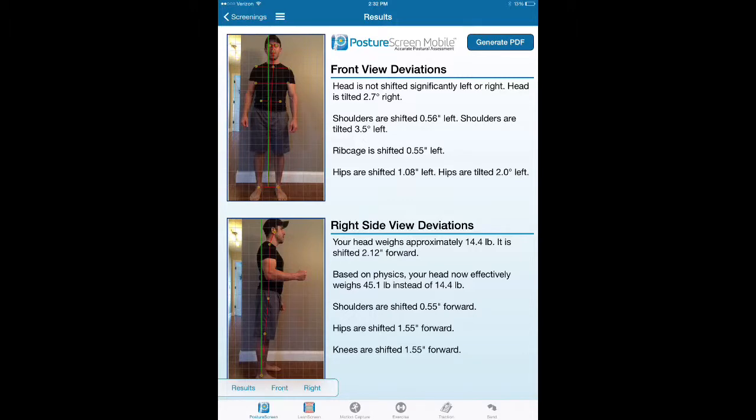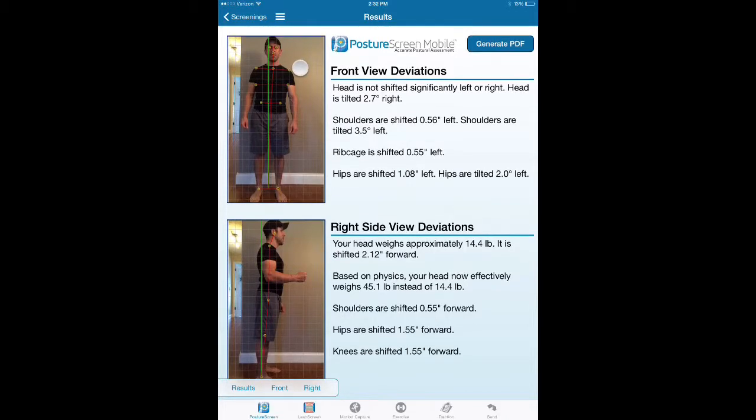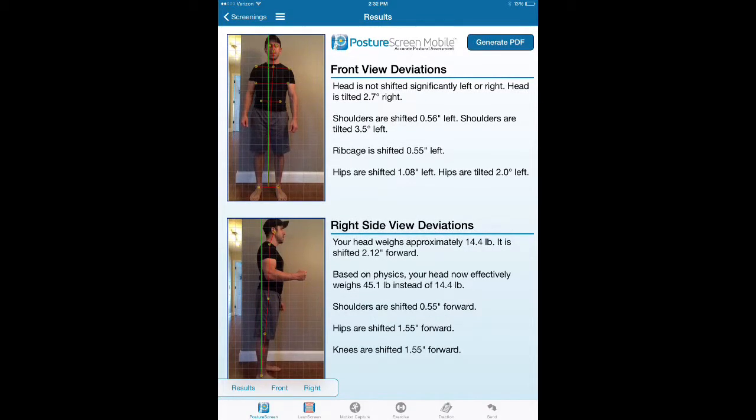That's an educational point, and at some point in time, we will go ahead and add displacements from the green plumb line, but that's not really a valid measure. What you really want to know is describe either the lateral flexions to a known constant, which would be the level of the floor or the joints below.